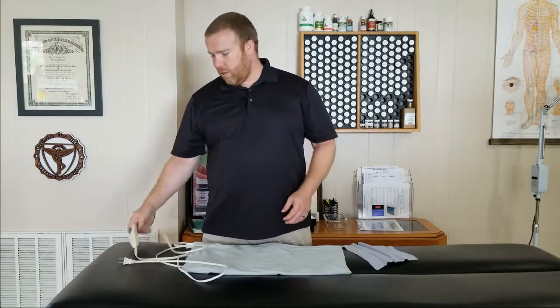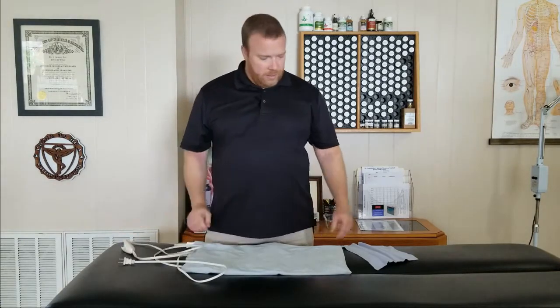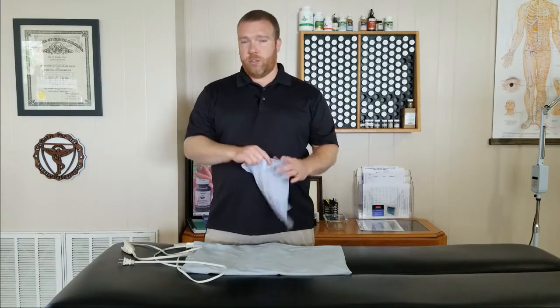The heating pad I'm going to demonstrate with is an electric heating pad. Nothing special about it. It plugs into the wall and has a little switch so you can decide how much heat you want. One feature that most new heating pads have is a piece of cloth. The cloth itself isn't important, it's just that you have one. If you have an older heating pad, you can just take a washcloth or something like that.